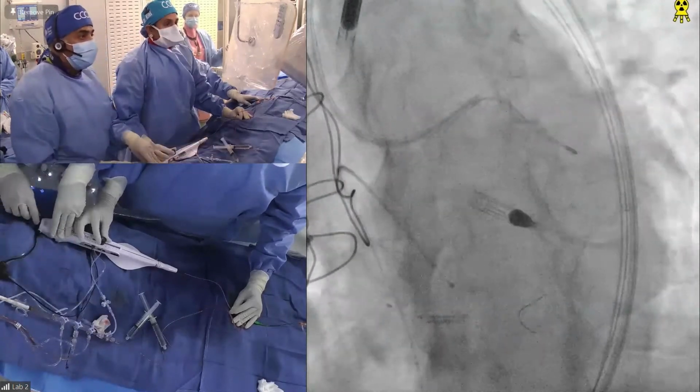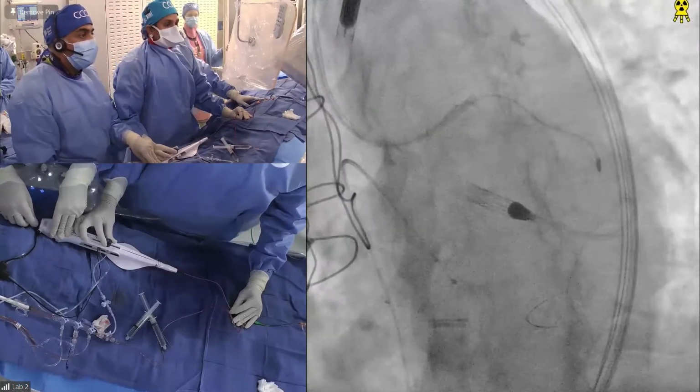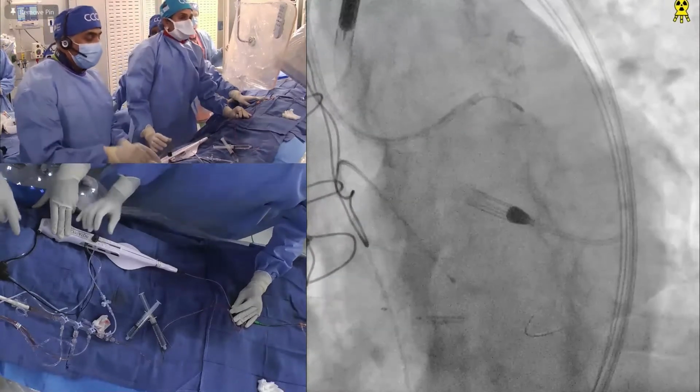Actually, for some of the tough cases, I'm working with Boston Scientific to make even a 1.0 burr. I think in this kind of case, even 1.25 may be too big.